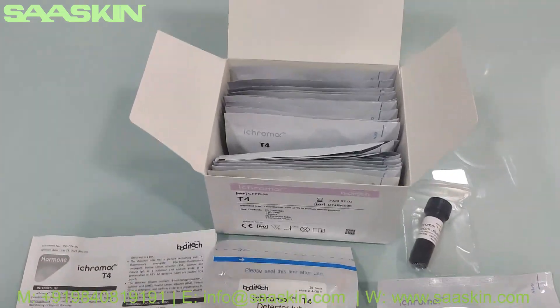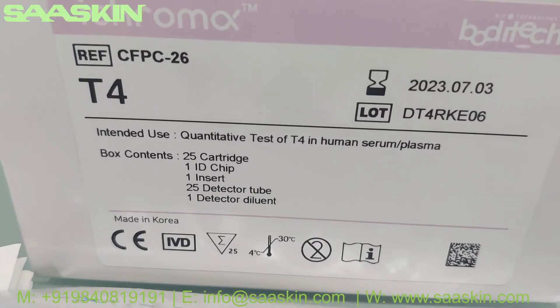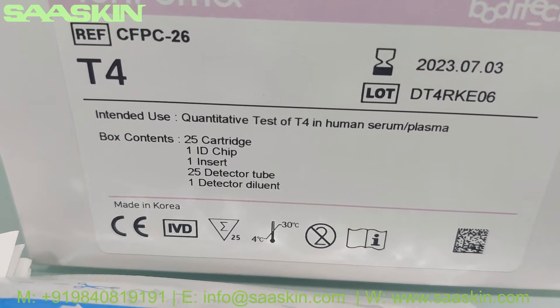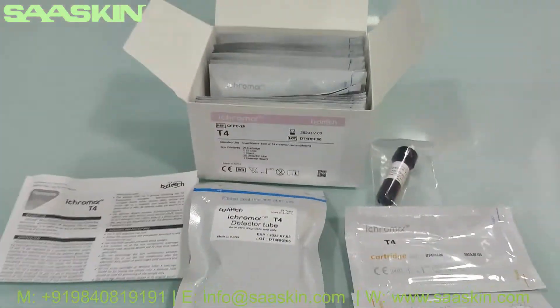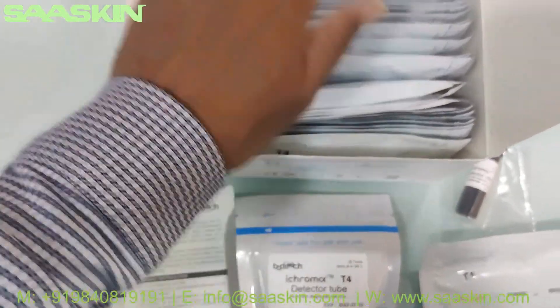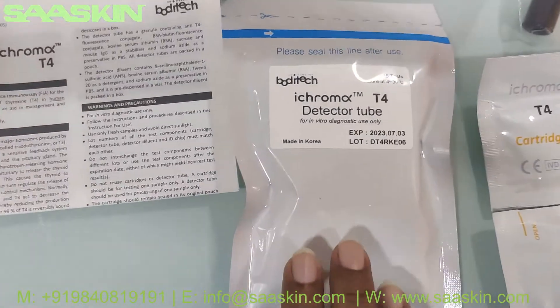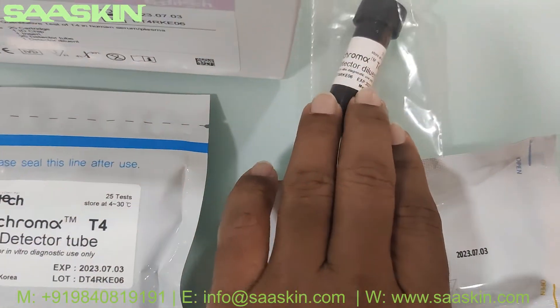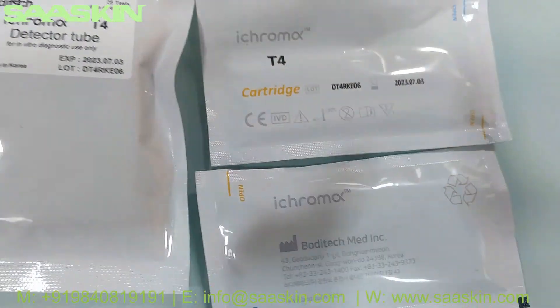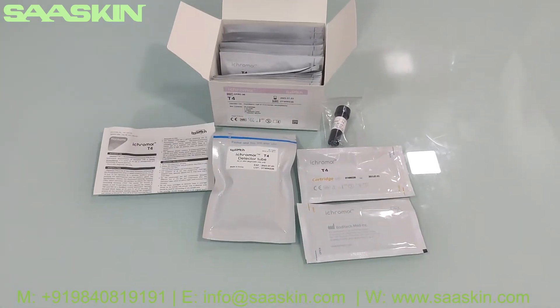Quickly to summarize: this is the unboxing of the ICHROMA T4 test cartridge kit, which is a quantitative test of T4 in human serum and plasma. This box contains 25 test cartridges, one ID chip, one package insert, 25 detector tubes, and dilution buffer for 25 tests. This is the complete test kit introduction for ICHROMA T4.